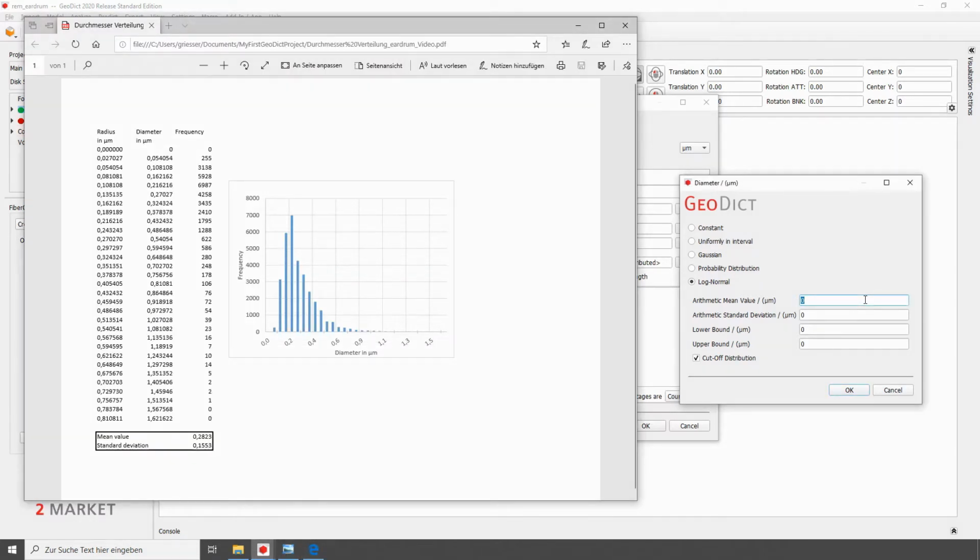Here, we now enter the arithmetic mean of the distribution. And here is the standard deviation. Like a lower and an upper limit, since we have chosen a voxel resolution of 0.05 micrometer, our lower limit of the distribution should be greater than this value if possible. We can also choose an upper limit. If we look at our distribution, we choose 1.5 microns.